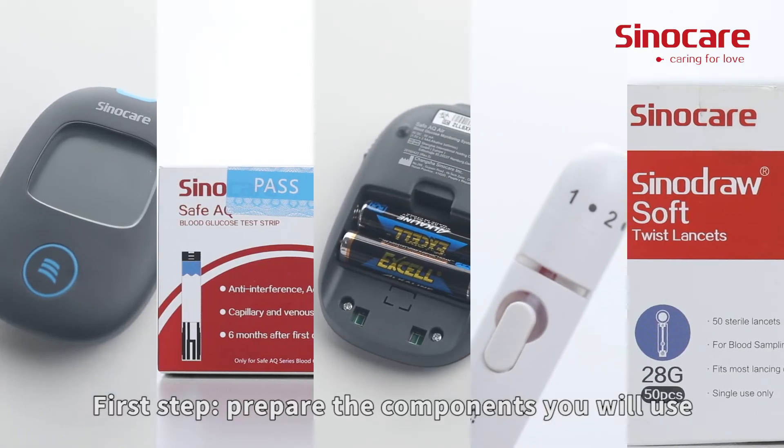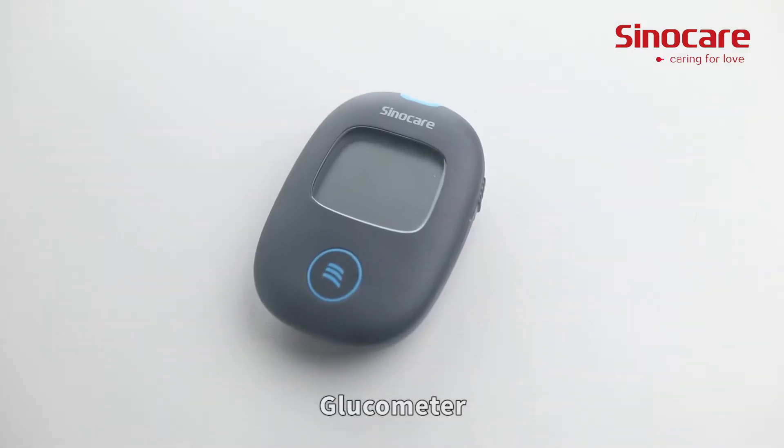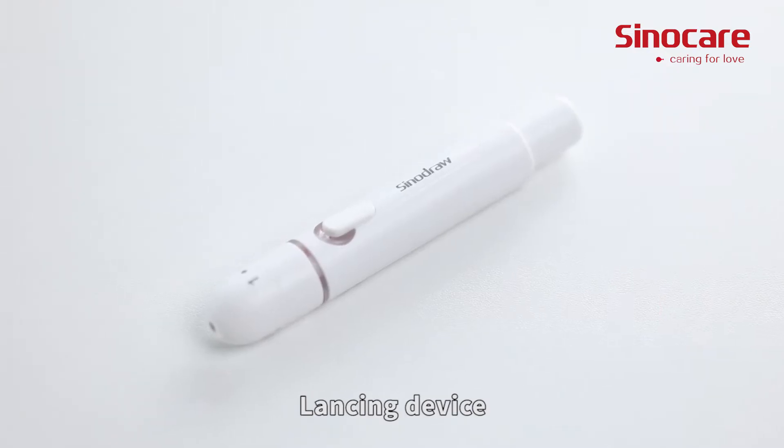First step, prepare the components you will use: batteries, glucometer, strip vial, lancing device, and lancets.